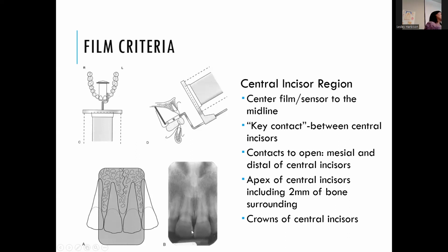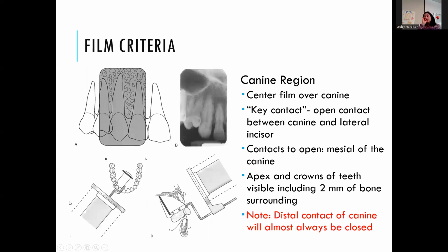They may have you retake it, but it is an area that you can actually visually look at. You can look at the incisal edge and see if something's going on. So you don't always have to retake that. The next one is the canine.